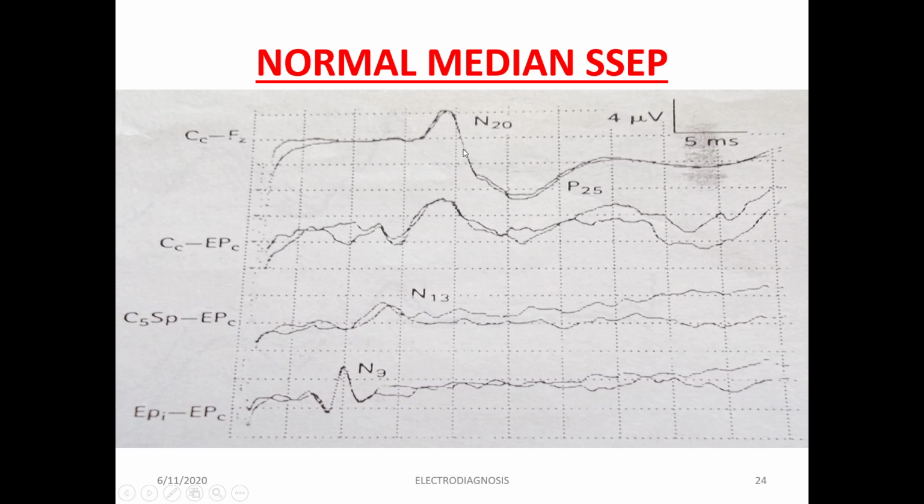So here 1, 2, 3, 4. Okay, so here you have this peak of the amplitude. So 4 means total 5 into 4, so that is 20 millisecond. You can think of this as P25. P means it is below the baseline because it is considered or correlated with repolarization. So here we have to identify this location.